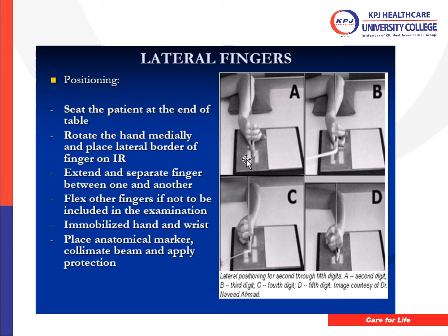Some go for this one, much closer to the image receptor, much easier. So then even the use of the immobilization aids here, some are used to immobilize the patient and to make the patient more comfortable.